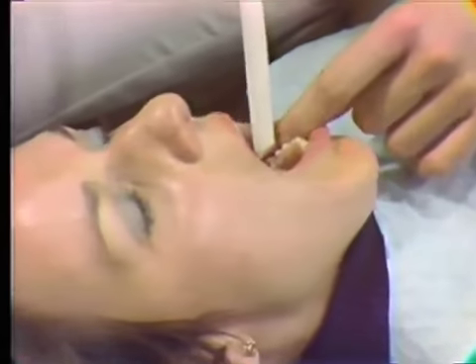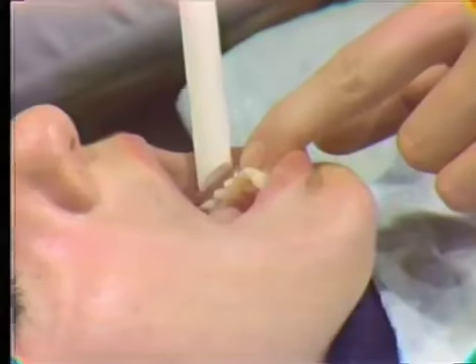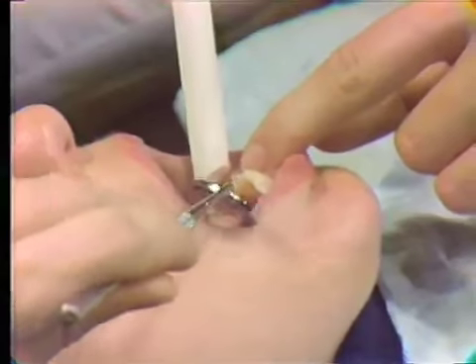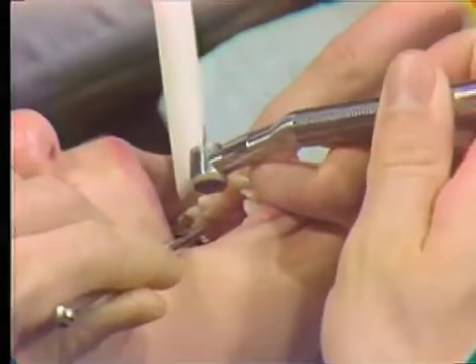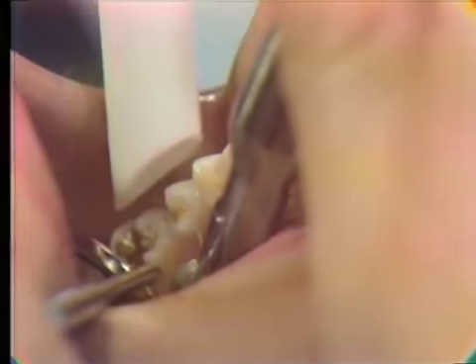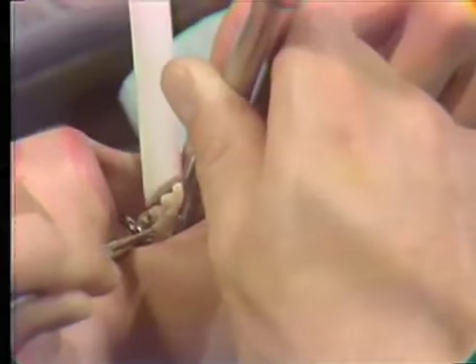The cheek can be retracted with the evacuator tip and the assistant's left index finger when necessary. The tongue is retracted by the operator with the mouth mirror. A finger rest can be established on the mandibular anterior teeth. The evacuator tip opening is placed parallel to the buccal surface of the tooth being treated. One half of the tip opening should extend above the occlusal surface of the tooth. Access is somewhat impaired in mandibular areas due to the presence of the tongue. Proper retraction using the hands of the dental assistant and retractors can overcome this interference.